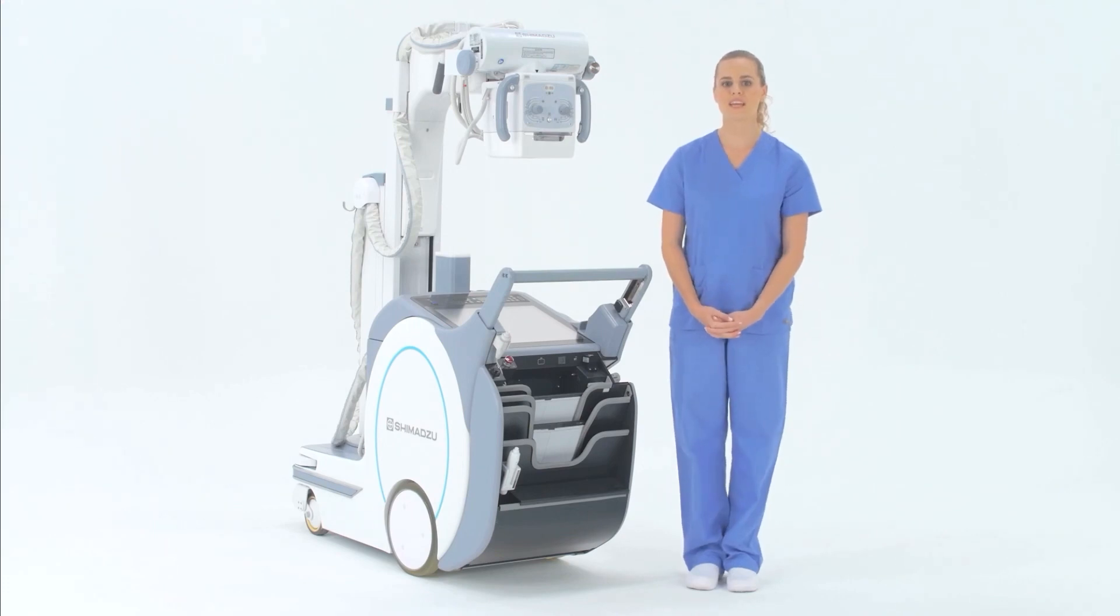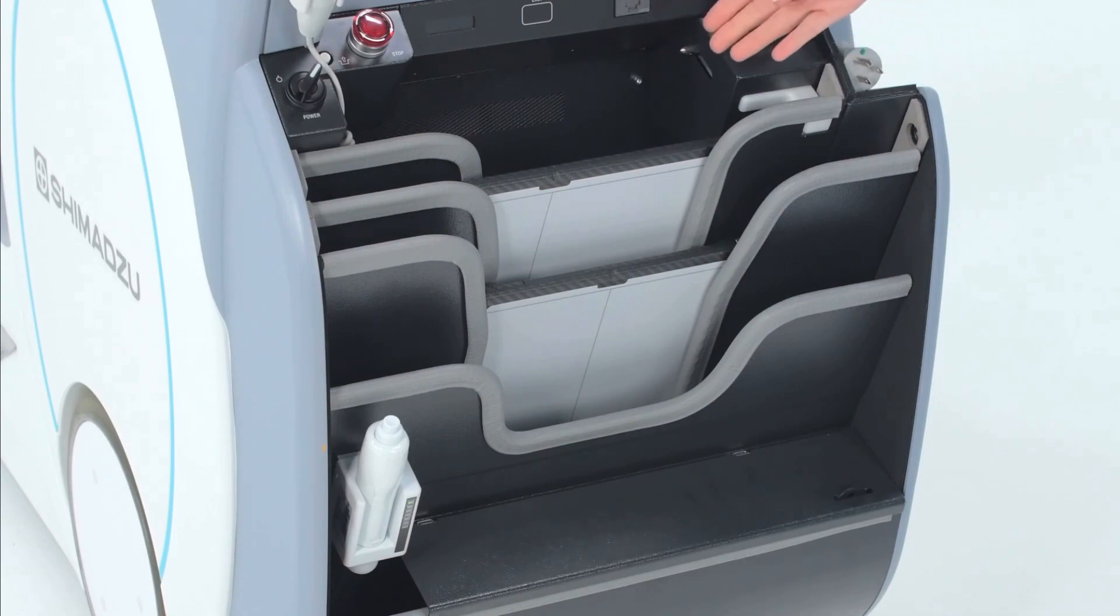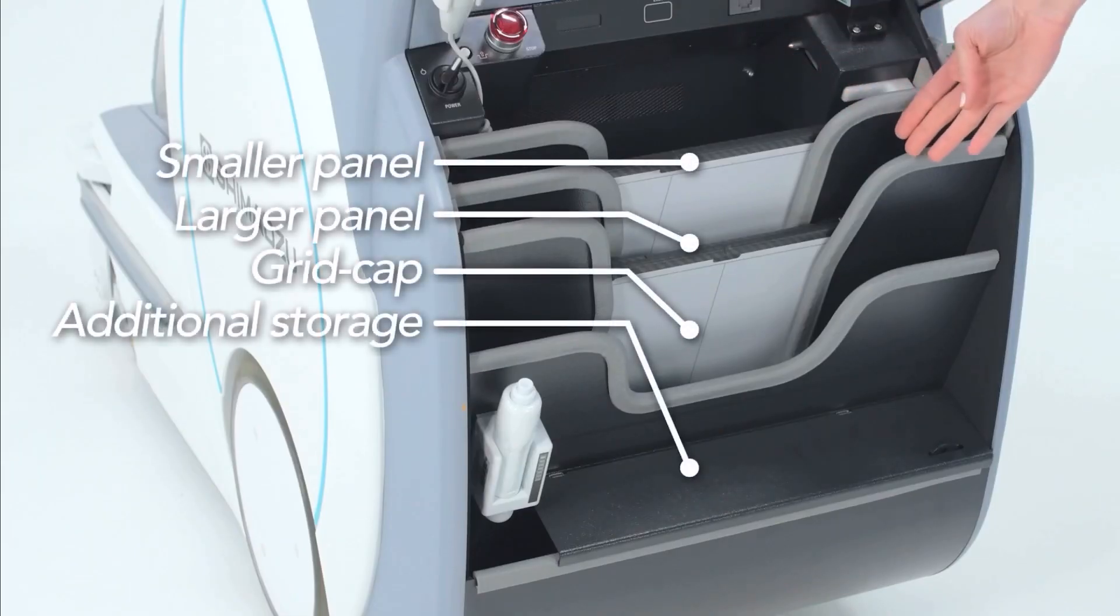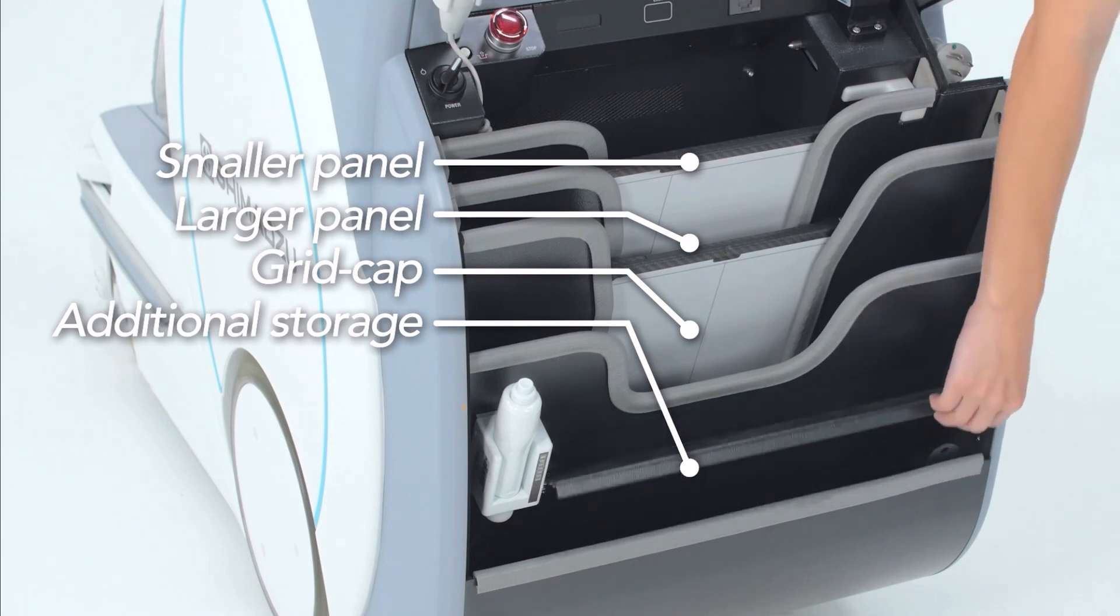Storage on the back of the unit has been upgraded to provide a space for paperwork and a charging cable for the panels. There are then slots sized to accommodate a smaller panel, a larger panel, and your grid cap. At the bottom there is a compartment for additional storage.